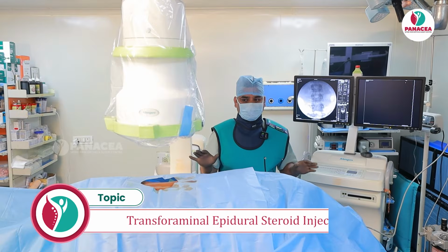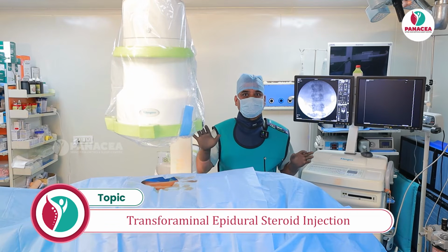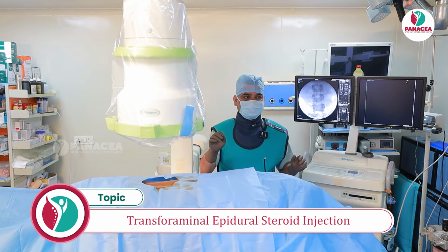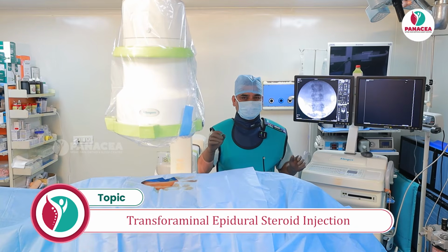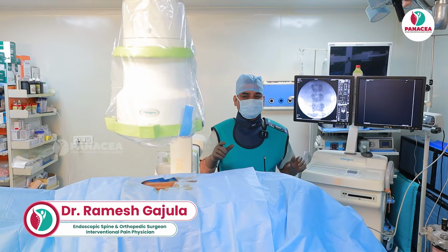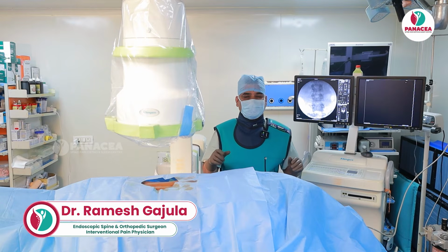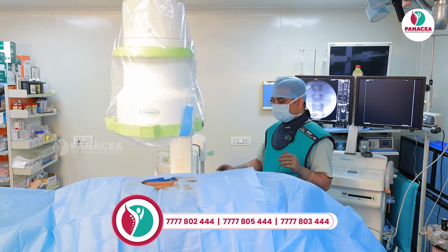The procedure proper is first to take an AP shot, so that in the AP shot the spinous process should be equidistant from both the pedicles. The pedicle to spinous process distance on either side should be the same. Otherwise, you should suspect there is some tilting of the table, or that the C-arm is not positioned exactly at 0 degrees.